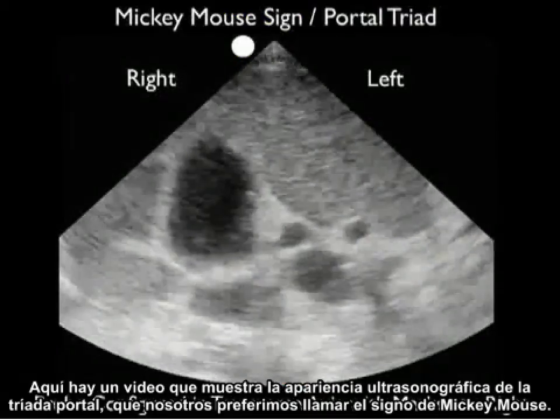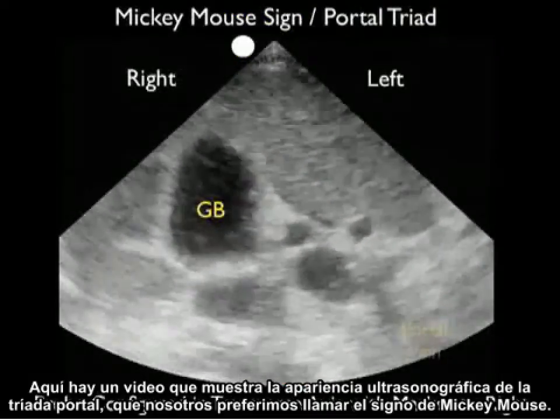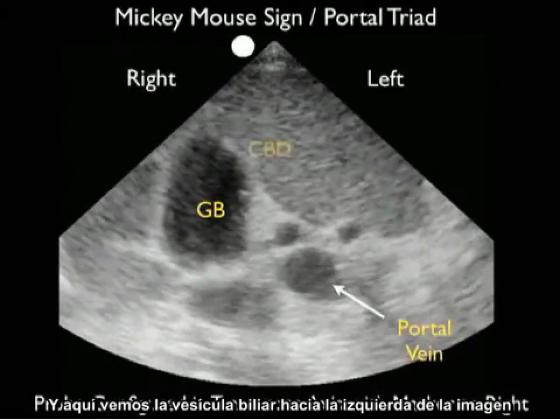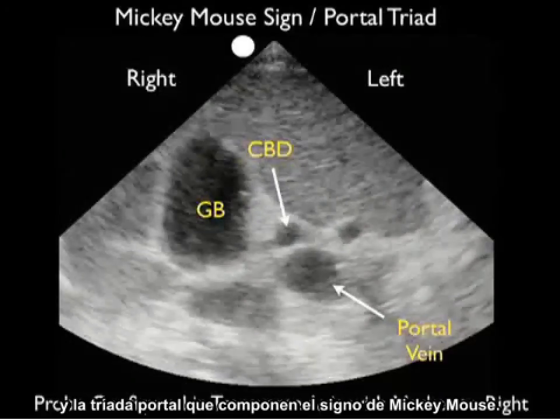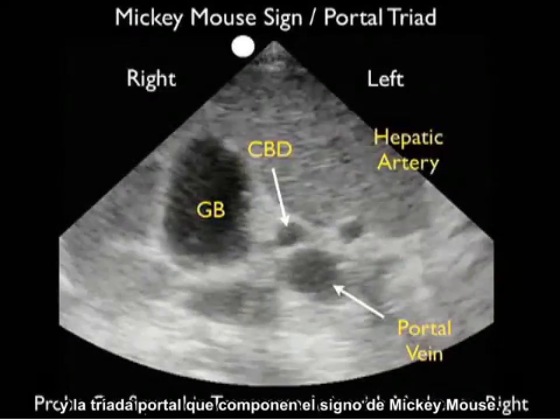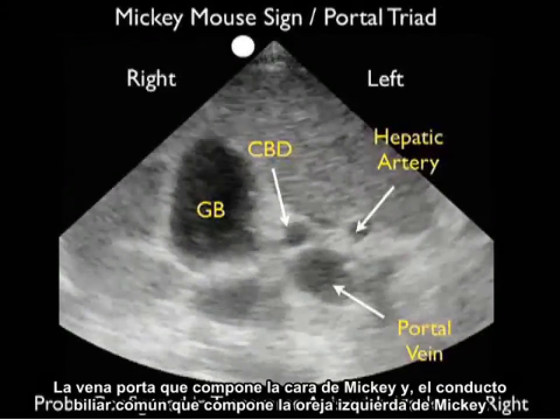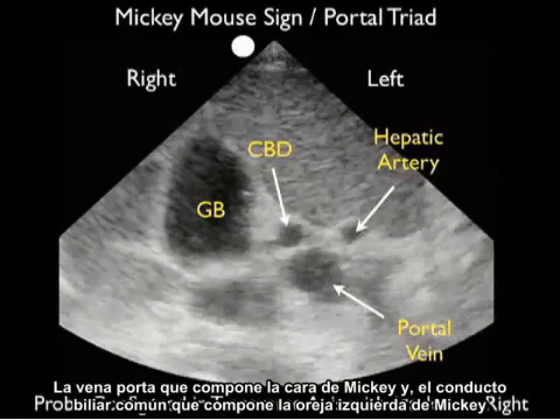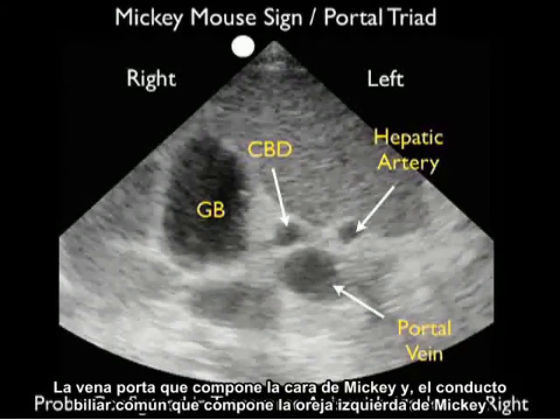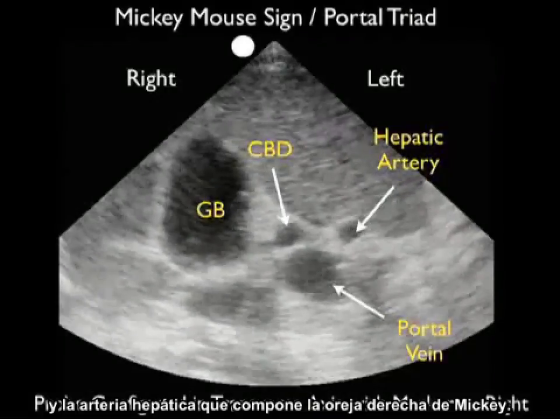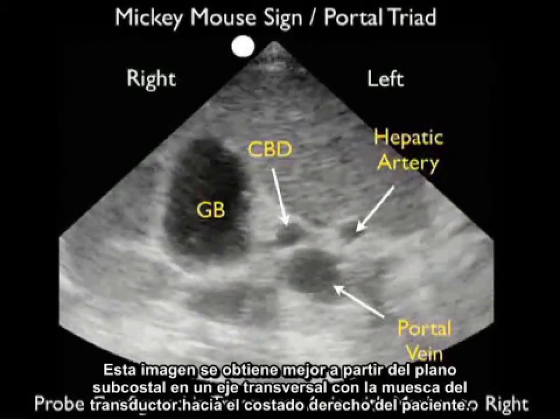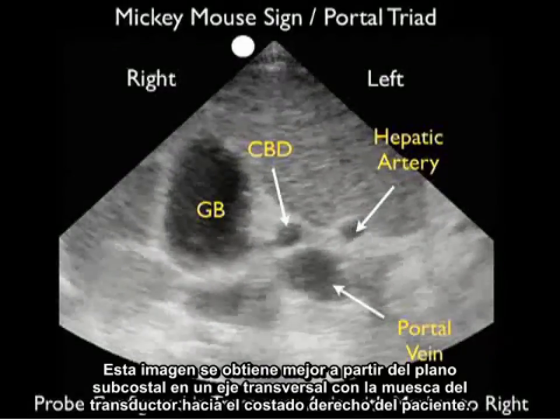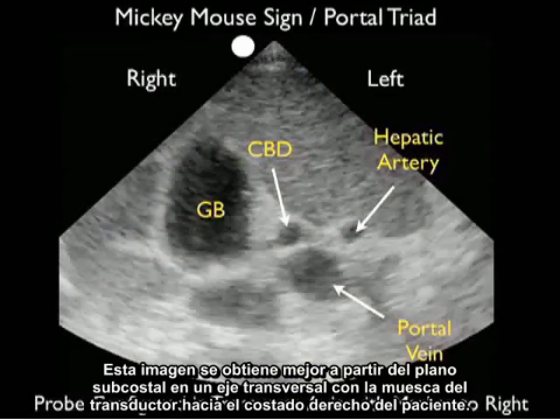Here's a video clip showing the sonographic appearance of the portal triad, which we refer to as the Mickey Mouse sign. We see the gallbladder towards the left of the image, and the portal triad making up Mickey Mouse: the portal vein makes up Mickey's face, the common bile duct is Mickey's left ear, and the hepatic artery is Mickey's right ear. This image is best obtained from a subcostal plane in a transverse axis with the probe marker towards the patient's right side.